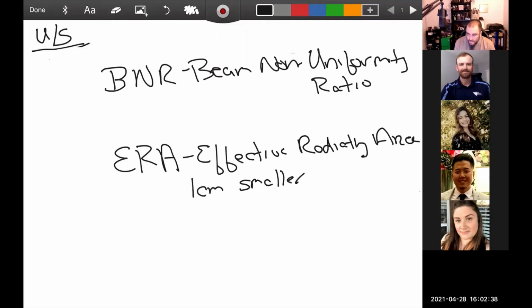it's on the tags. So if you get a question on your test that says, where would you find the ultrasound's ERA and BNR? It's on the tag on the ultrasound head. I'm going to say that again. If you get a question that asks you, where do you find the ERA and the BNR? It's on the tag on the ultrasound head. Every ultrasound head has to have it.